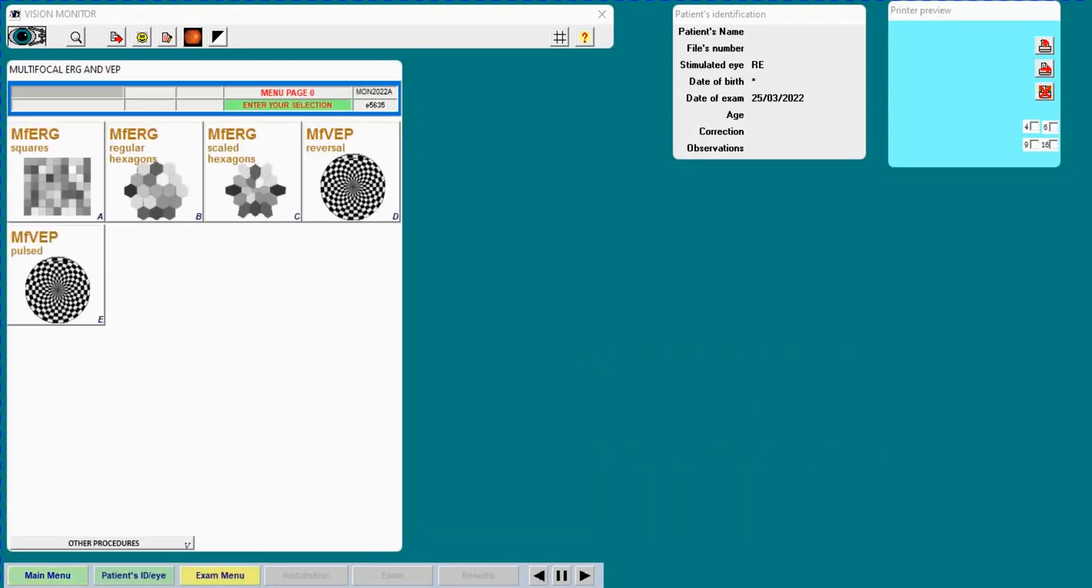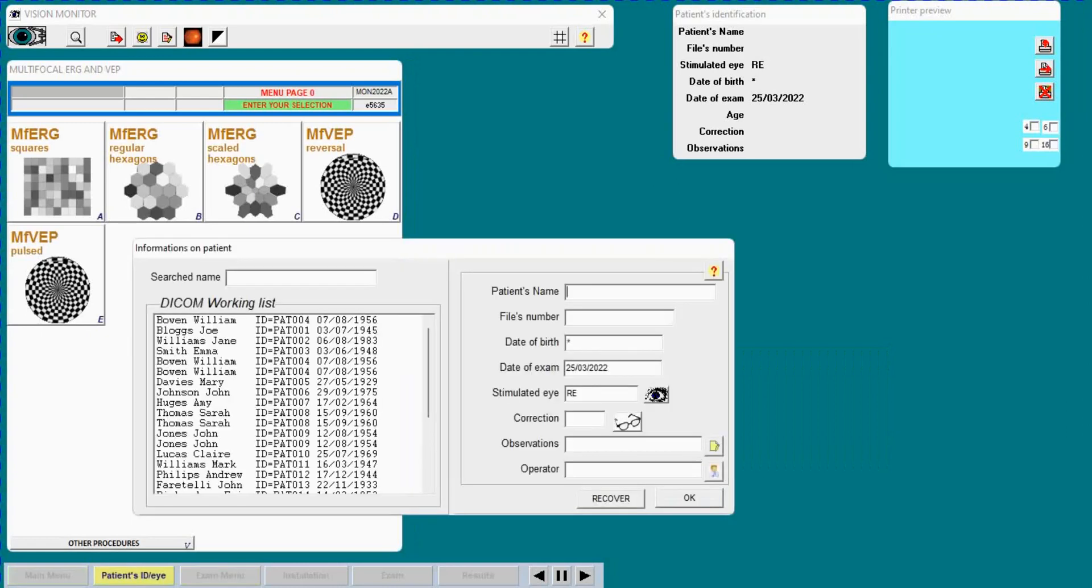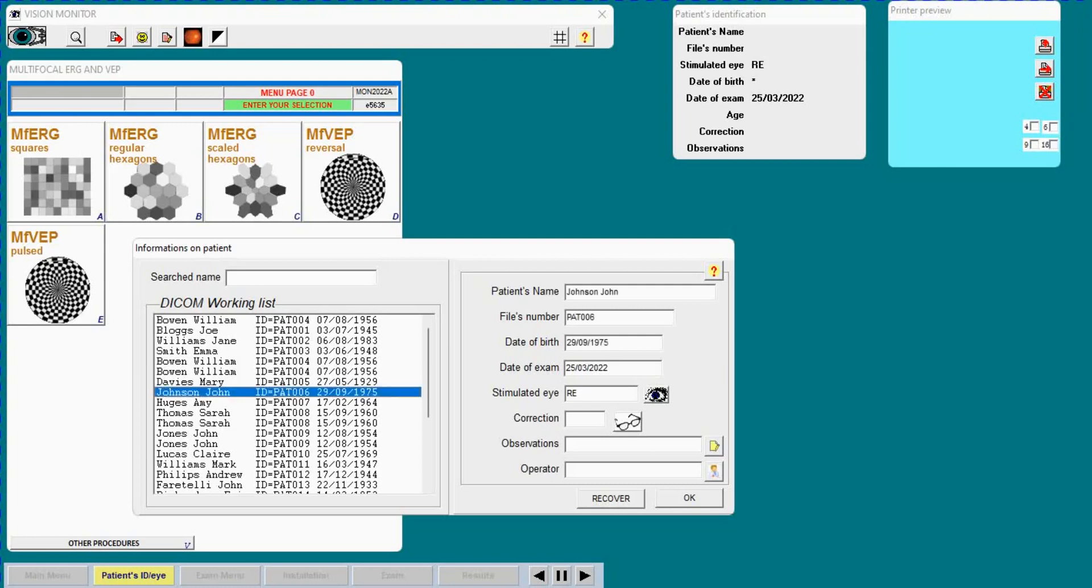Here we go. First thing I do is identify the patient. Here I am connected to a DICOM server. This is the list of patients scheduled for today, so I will select this one.